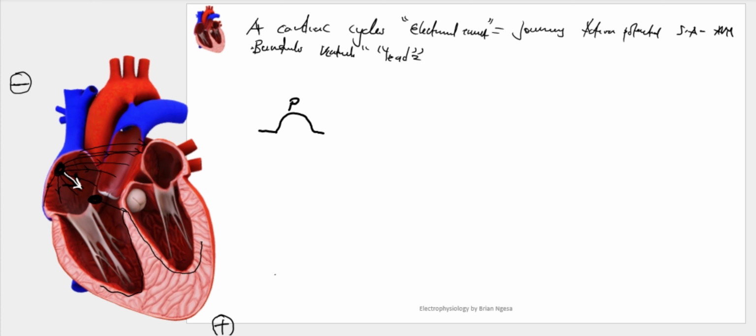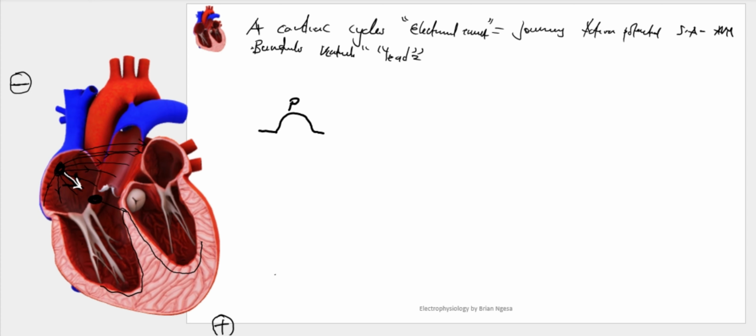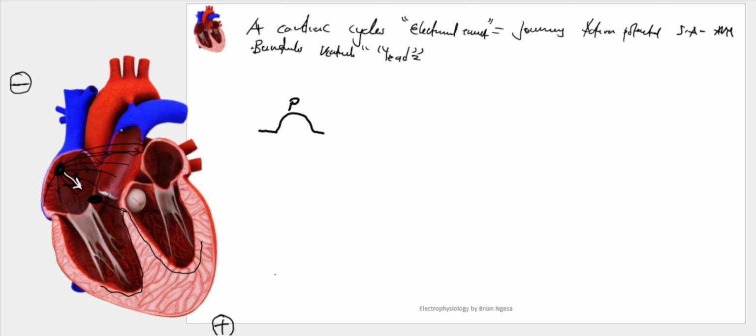So we have some action potential, but the atrioventricular node has the tendency to delay the movement, holding them a little bit before deciding to let go. So that's what we are likely to see in our ECG graph.